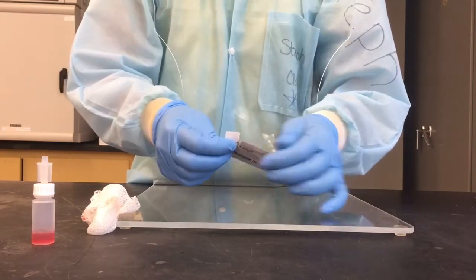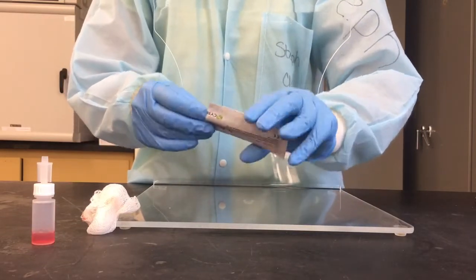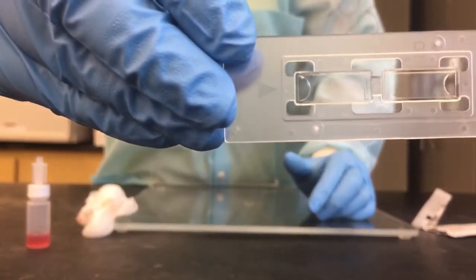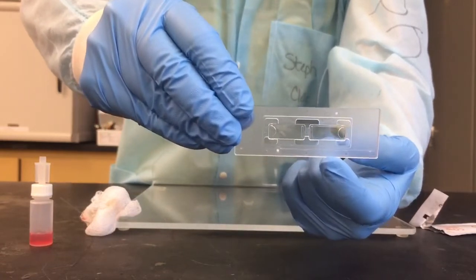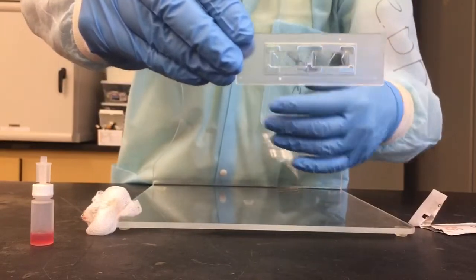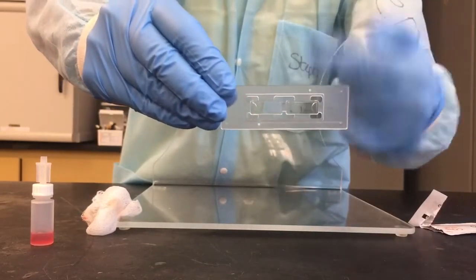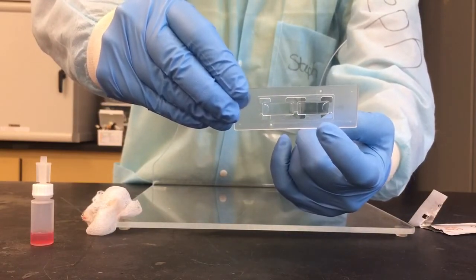So when you open your hemocytometer, there'll be a little tear strip at the top. You're going to open it up, take out your hemocytometer, and then this is what it's going to look like. Your hemocytometer will have 2 different sides to it, an A side and a B side, and in each of these sides is an actual counting grid, and we're going to go to the board in a little bit and look at what that grid looks like. But when we do our counts, we are going to count both the A side and the B side, and when we load our hemocytometers, these little half moon sections that are right here, that's the loading grid.